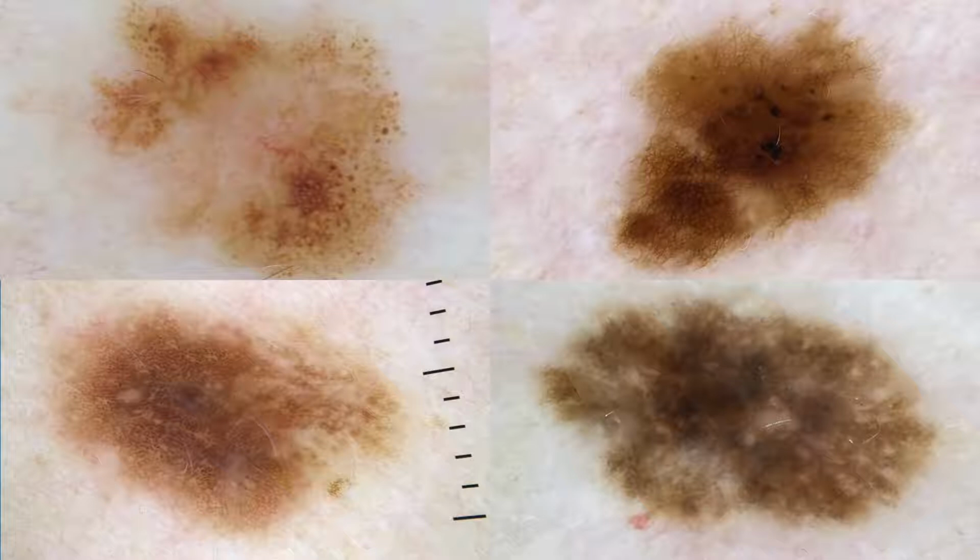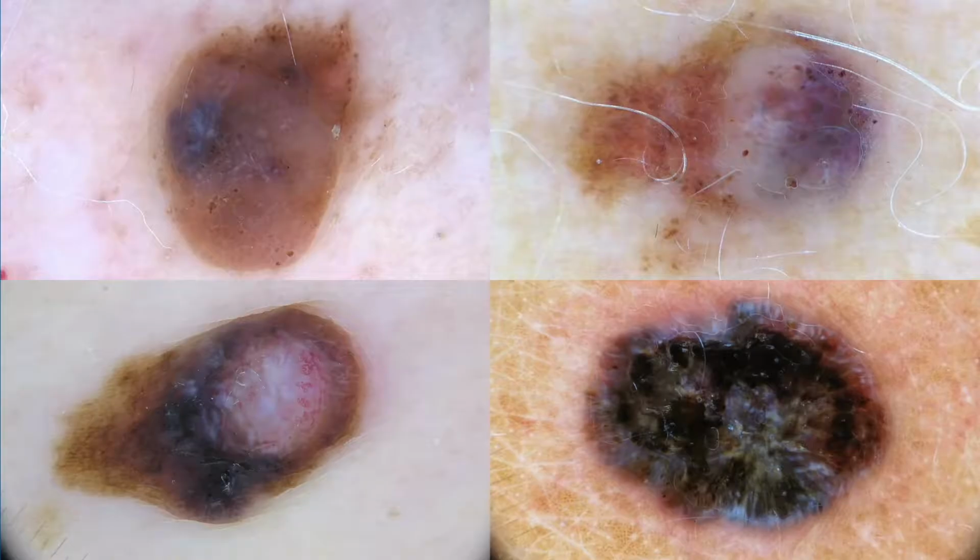As you can see in this image, we have 4 melanocytic lesions, which are quite atypical in terms of the dermoscopic findings, and they are all flat. They are all brown or black in color, maybe some regression in some cases, but these are melanoma in situ, and perhaps you might have guessed this from the clinical and dermoscopic appearance.